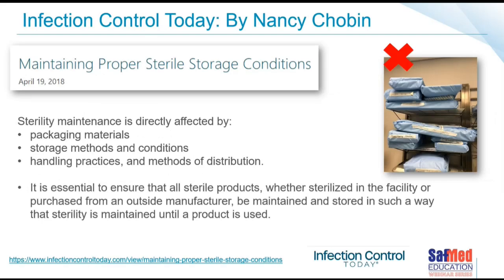Going through an article, this is in Infection Control Today. I'm not sure if it's anything you guys get access to or read every now and again. Infection Control Today is a magazine. It's not a journal, but some really good quality information is published in Infection Control Today and written by some people of good integrity that we know. So remember these concepts. In this, maintaining proper sterile storage conditions, some aspects to remind ourselves.